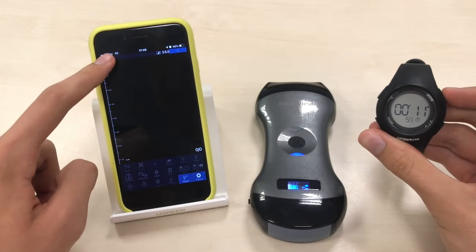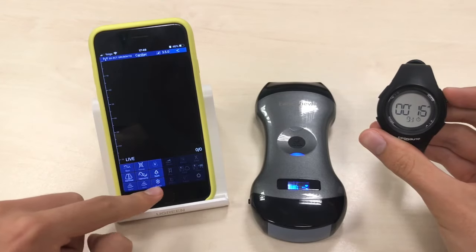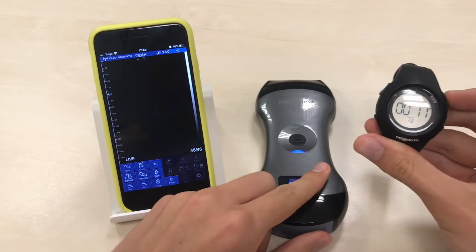Now you'll see the boot-up and pairing process. As you can see, it connects through a WiFi network, which it has detected right now, and we're able to scan — just 17 seconds to be ready.